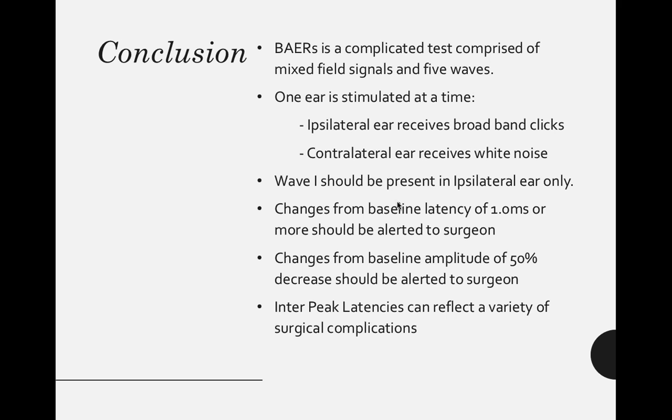Wave 1 needs to be present in the ipsilateral ear only. That is going to indicate that your clicking is good and your masking in the other ear is good.